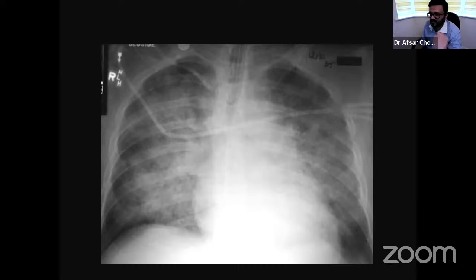I can say, okay, this is a proven benign finding. You don't have to do that. But that's not the case when you're dealing with a chest X-ray. Many of the CTs we refuse. I do refuse a lot of follow-up CT scans where the specificity goes higher, where you can say, oh no, this is benign, I'm sure, you don't need a follow-up CT in this. But that's not the case with X-ray. The specificity is not that high in X-ray in most of the cases. Yeah. Excellent, thank you very much.